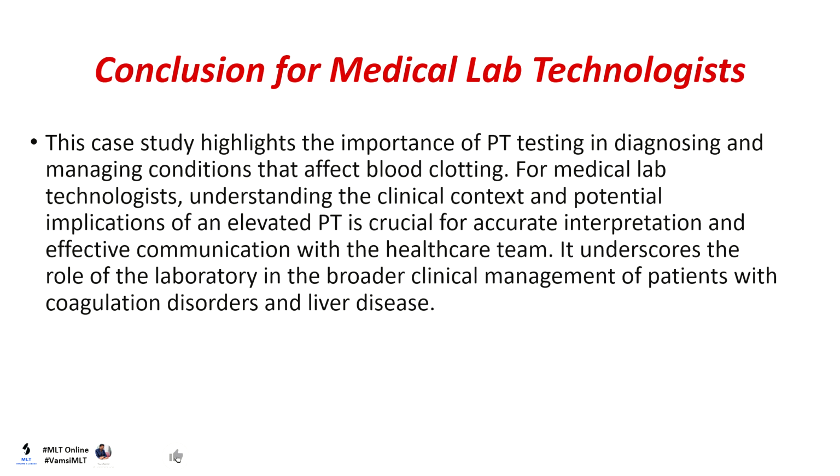Conclusion for medical lab technologists. This case study highlights the importance of PT testing in diagnosing and managing conditions that affect blood clotting. For medical lab technologists, understanding the clinical context and potential implications of an elevated PT is crucial for accurate interpretation and effective communication with the healthcare team. It underscores the role of the laboratory in the broader clinical management of patients with coagulation disorders and liver disease.